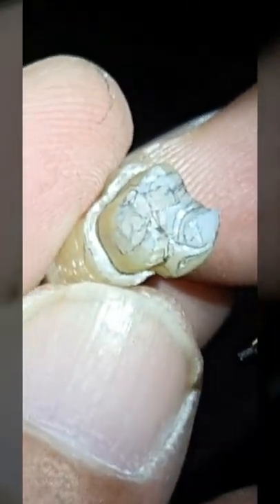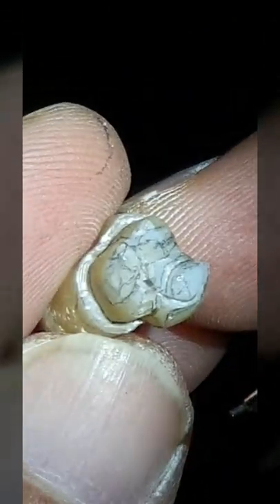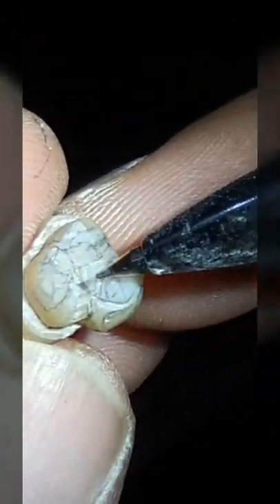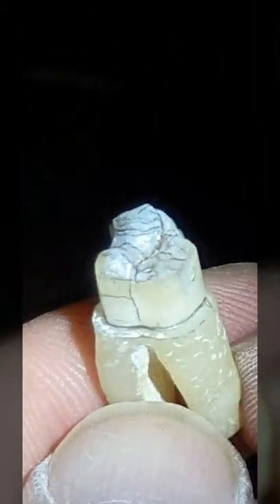We have come from a class 1 inlay to a distal occlusal inlay to an MOD inlay to an onlay to overlay to 3/4 of a crown, now 7/8. To continue on to a complete crown, all you have to do is continue the prep into here and incorporate it, but we'll leave it at this. Hope this teaches you, and hope you can utilize this technique in your clinical practice or your examinations.